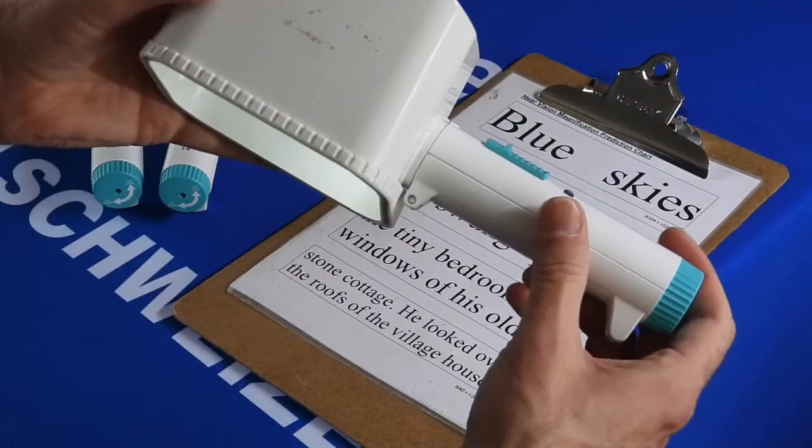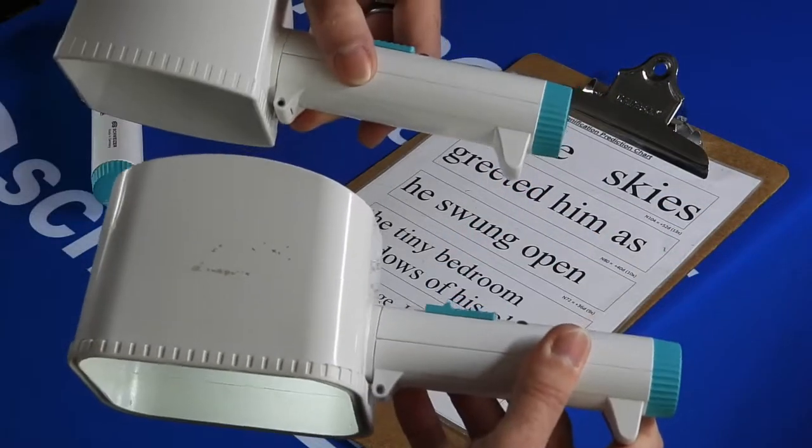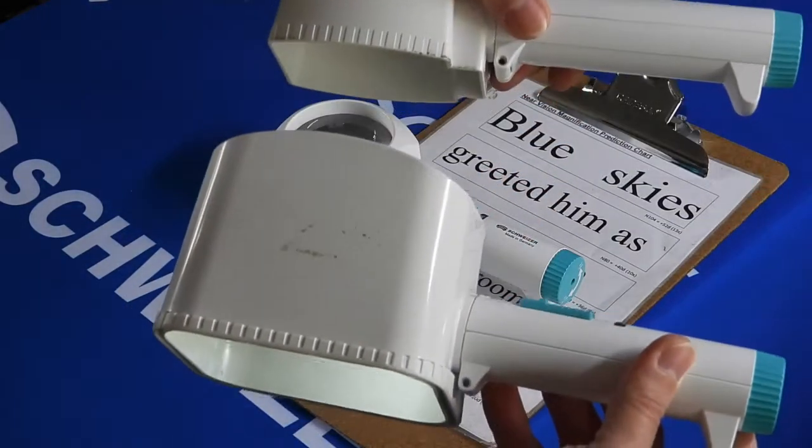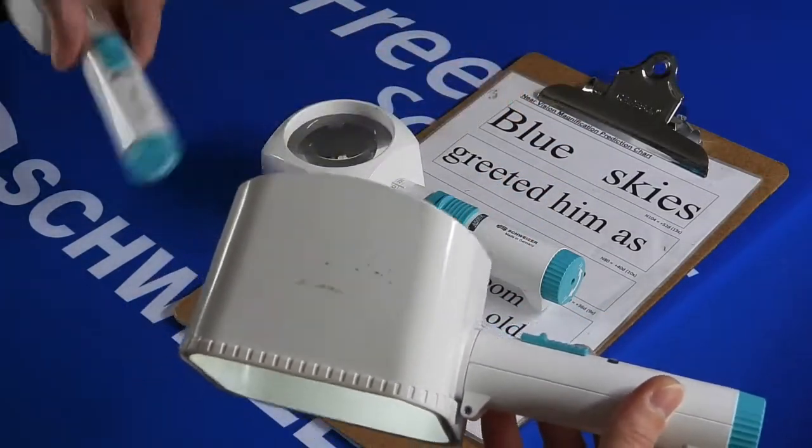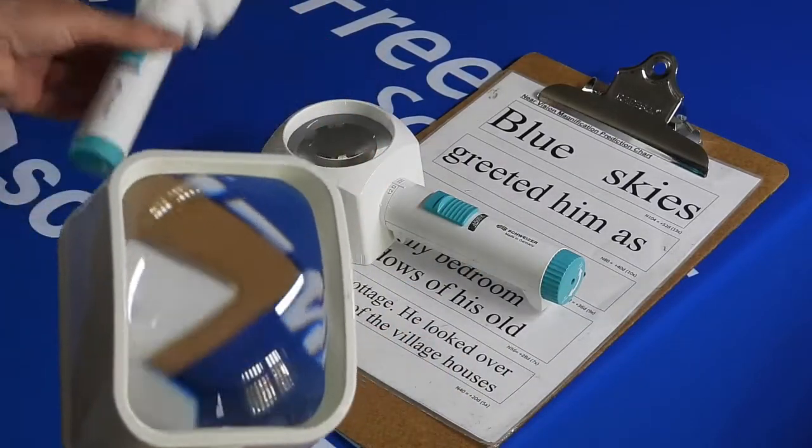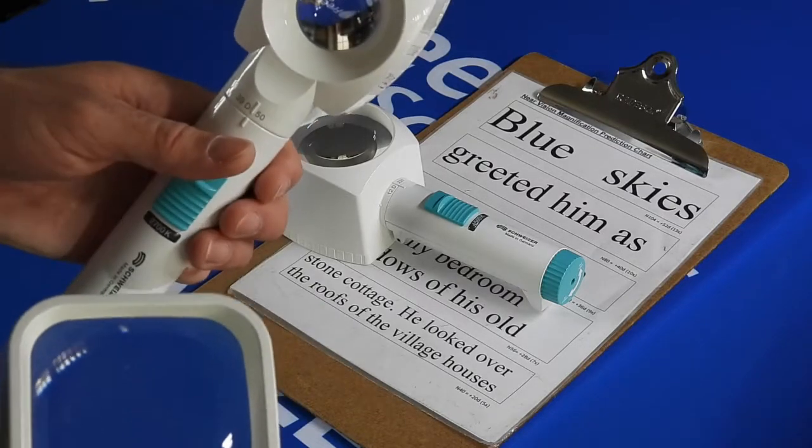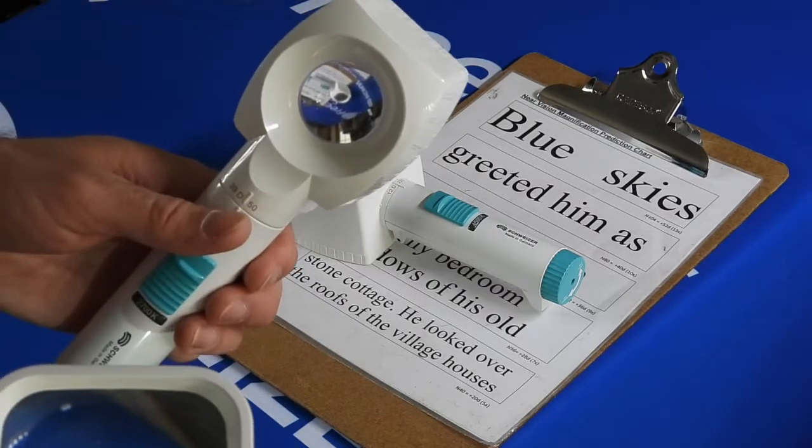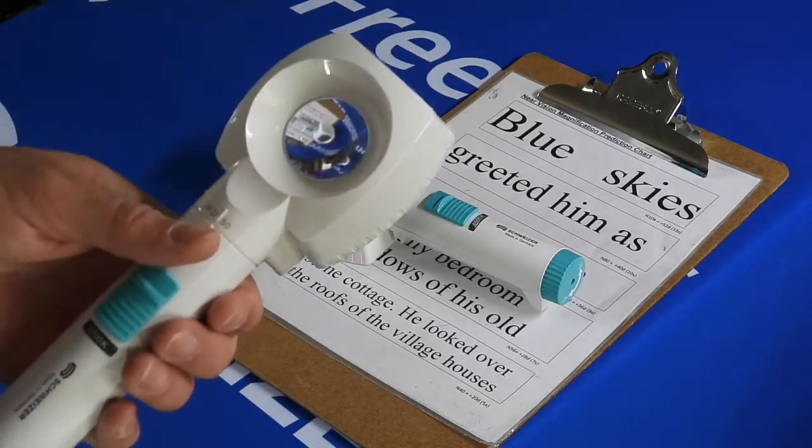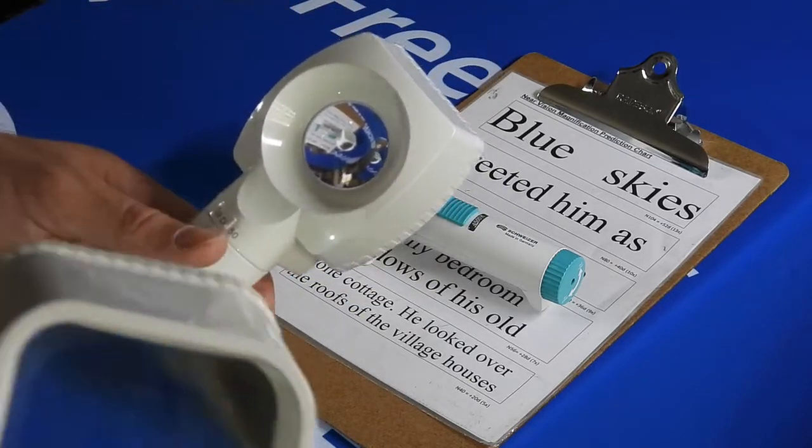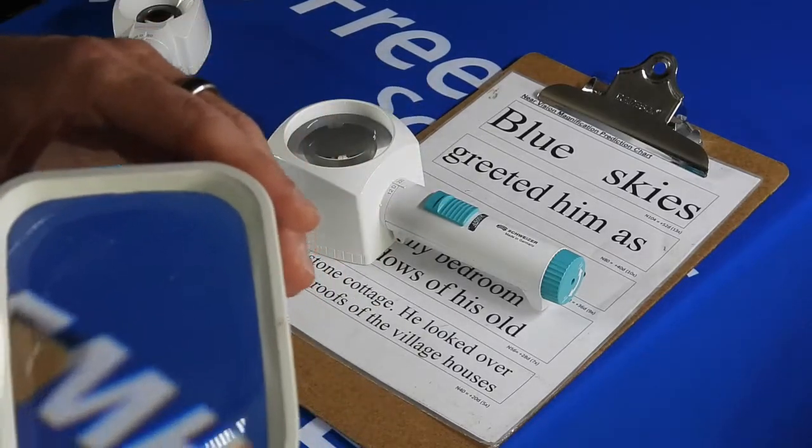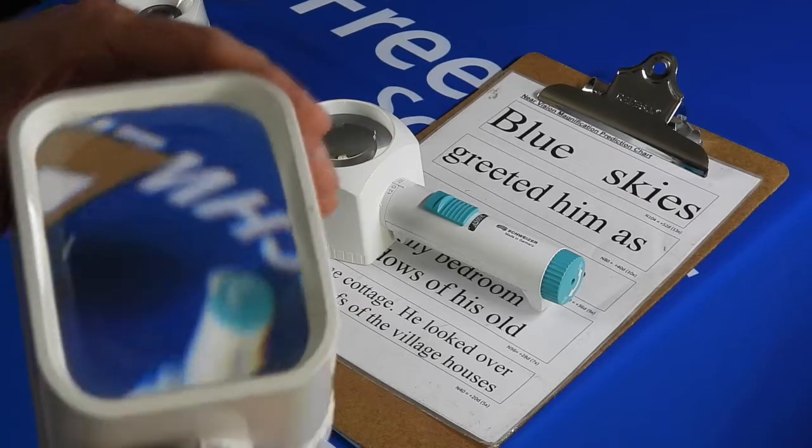You'll notice that these heads are smaller as the power increases. You may remember: the larger the lens, the less powerful it is; the smaller the lens, the more powerful it is. But the trade-off is you have to get a lot closer to the reading material with the smaller higher power ones. The larger lenses are more forgiving and have a better field of view.